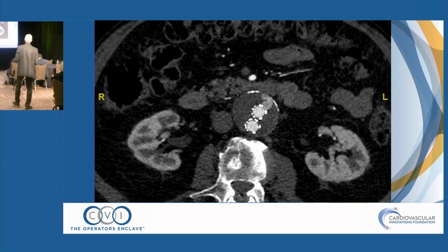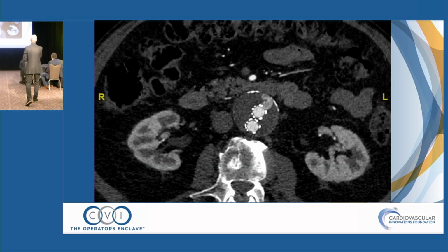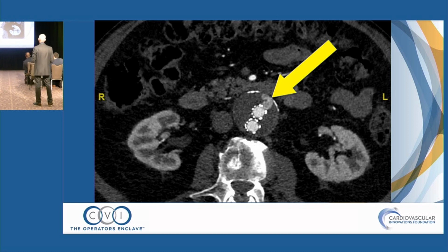That's editorial. Anyway, here's this CT scan, and you can see there's an endoleak there. That's probably coming from an IMA. Should we do anything about this? 5.2 centimeters, it's asymptomatic, one-year follow-up, 80 years old. Who would fix that?